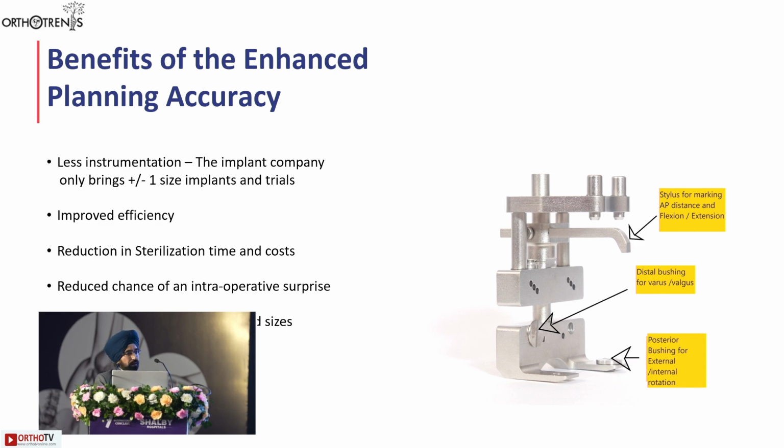So we can easily plan and do it. It is like pre-operative computer navigation. We plan before going to the OT, and there we don't need to use any intramedullary jig. Even if we don't have computer navigation or a robot in the OT, we can use this jig for cases where an extramedullary approach is required, like with an intramedullary nail or any femoral deformities. With planning beforehand on the CT scan-based software, we ourselves as surgeons can plan that surgery.